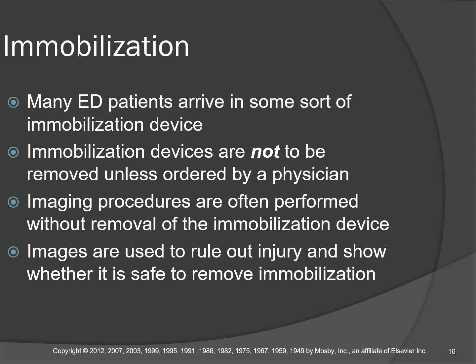If that's the case, you do need to excuse yourself from the patient. Go track down the ED physician and ask him, okay, you've got this knee x-ray and this tib fib ordered on Mr. Smith in bed 24, whatever it is I just said. They got an immobilizer on. Do you want me to shoot the radiographs with the immobilizer on? It's going to have an artifact posteriorly, so the AP views are going to be compromised and superimposed with steel rods over the anatomy that you're trying to see. So do you want me to shoot with the immobilizer on? Do you want me to take it off, shoot, and then put it back on? What do you want me to do? Okay.